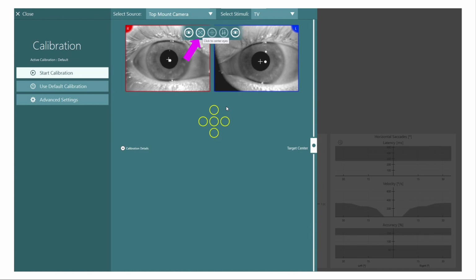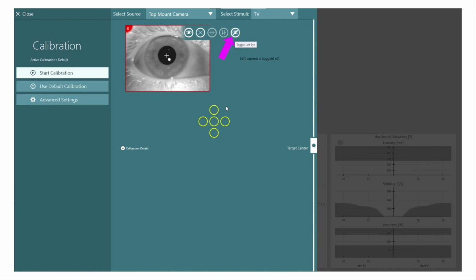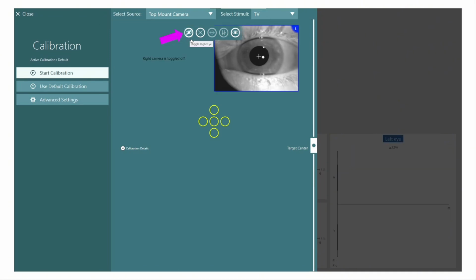The next thing we want to do, well, before I get to that, let's look at the toggles. This one on the far right over here, we can toggle the left eye off, or I can go back to the other side and toggle off the right eye. So if I only wanted to see one eye for whatever reason, I can do that. Sometimes someone has very poor vision on one side, or maybe they have a lot of scarring, or I can't get this little plus sign locked onto the pupil. If you see how the plus sign is really locked onto the pupil, but if it's bouncing around a lot, our tracings are not going to look very pretty. And so sometimes I'll turn one of the eyes off just so I can get nice tracings. Few reasons why we do that. I don't do that all that often, but you have that as an option.